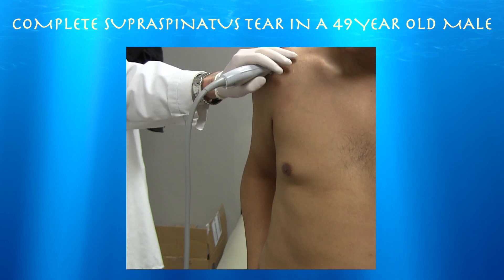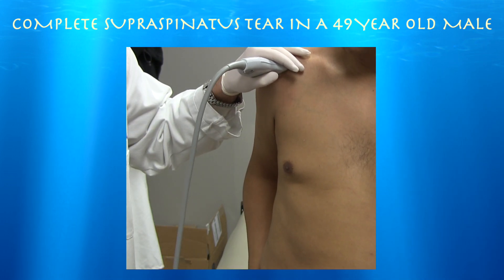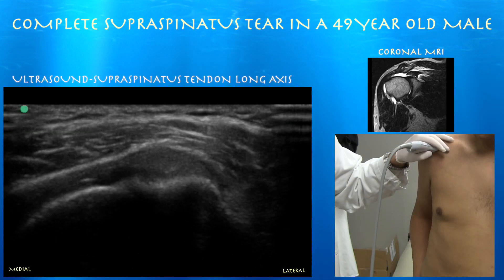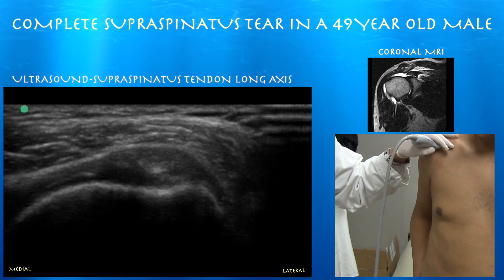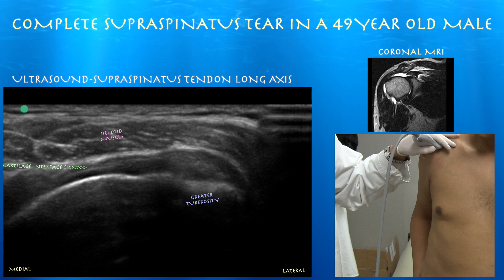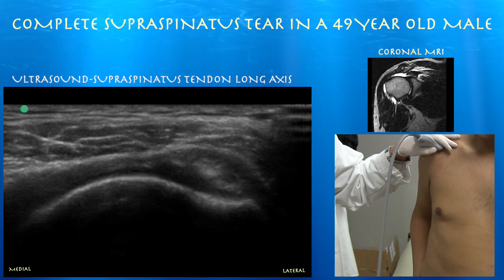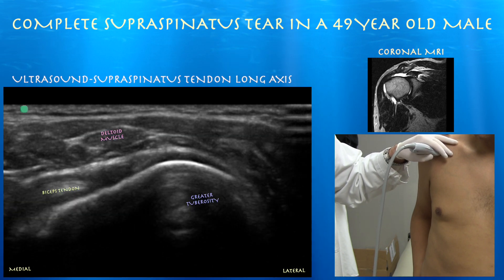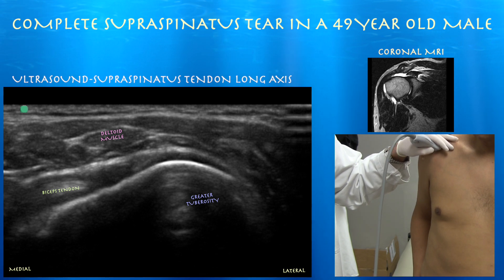This is the clip I'm interested in. You can see the greater tuberosity — and there's just nothing there, it's just a space. You can see a little cartilage interface sign — that little white line right above the humeral head is the cartilage interface sign, consistent with a rotator cuff tear, with some fluid interfacing with the hyaline cartilage. Here's the biceps tendon, so we know where the anterior margin of the supraspinatus is, and going posteriorly we just see nothing.